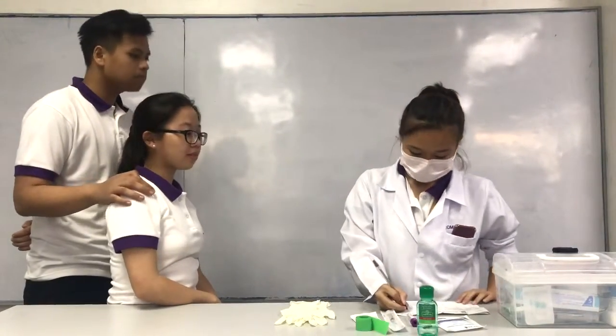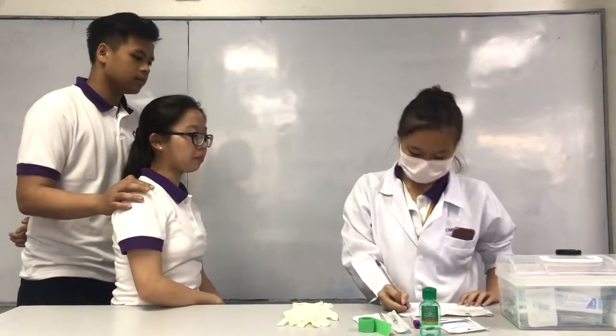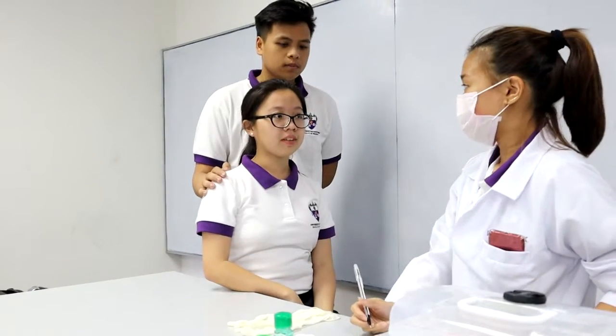Patient's name: Dana Criselle Mallon. Birthday: June 1, 2013. Age: five years old.